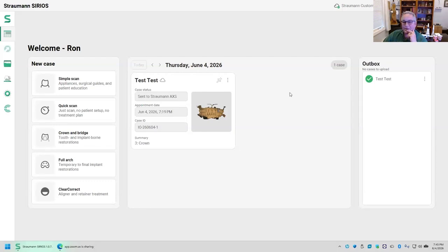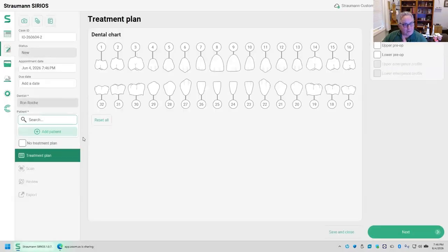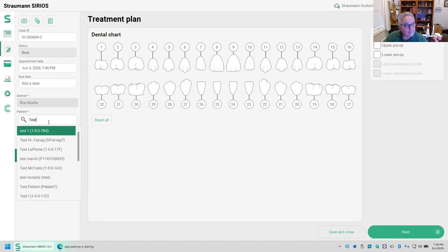Okay. Any questions on anything I presented? Ron, I have a question for you. Sure. So I know you touched on the tissue filter a little bit, but I think you have a presentation on full arch as well, but if you're doing a full arch, or if you're doing an implant bridge, you would adjust that tissue filter? Yeah, absolutely. And let me just show you one extra. I'm glad you asked that question, because I want to show you one more thing about that.